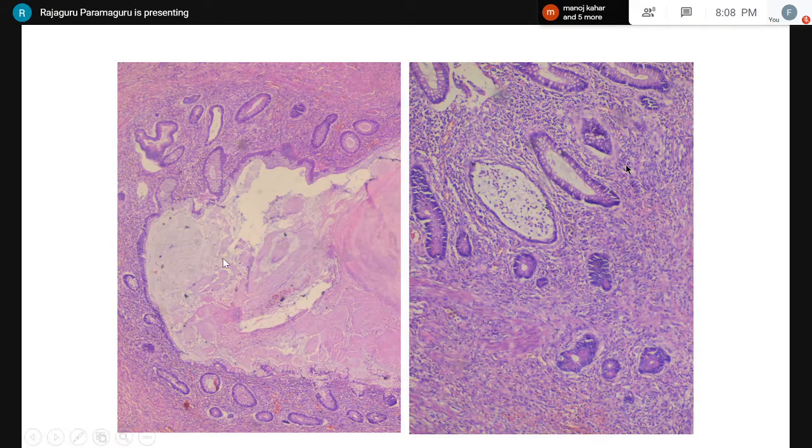So this is a case of an inflammatory polyp in ulcerative colitis. The patient had presented with giant polyposis, where you saw a lot of epithelial islands which got misplaced submucosally. What you see over here, the epithelium is hyperplastic and it is surrounded by a good amount of lamina propria. Here again, you see a lot of lamina propria, and the glands might appear dilated with mucin in them.